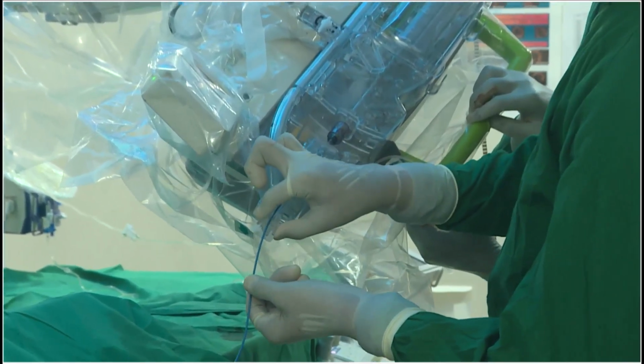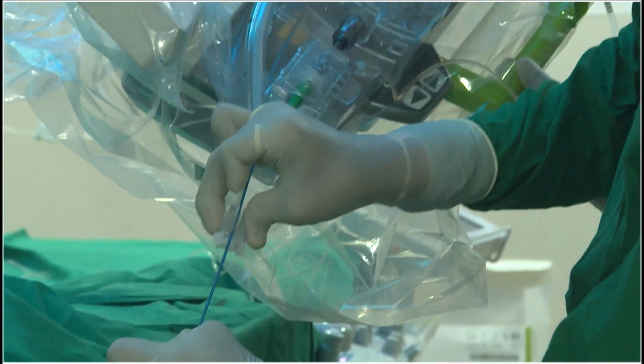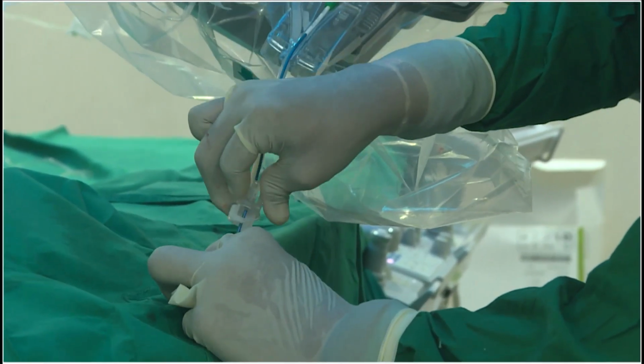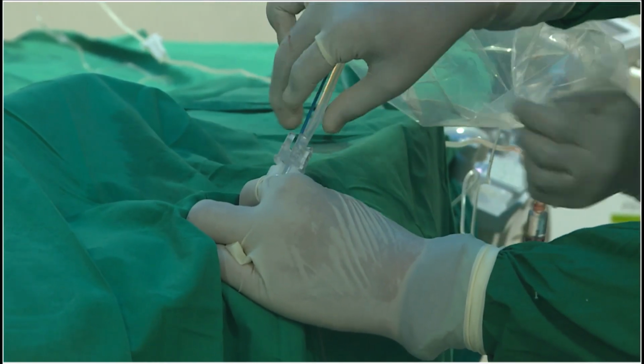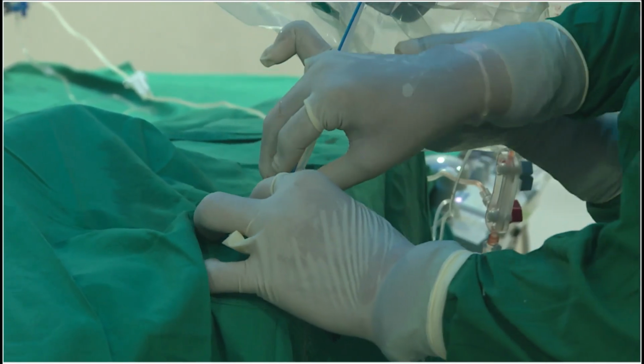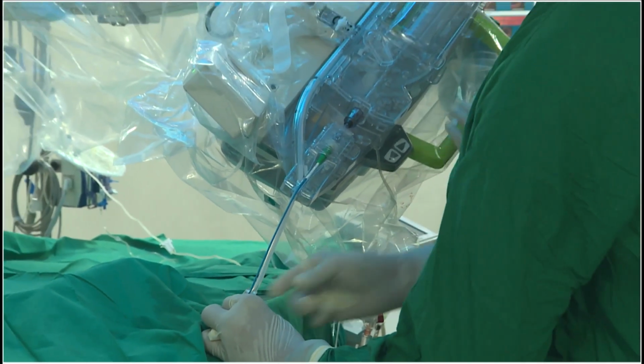So this is the arm we have to lock to the sheath, so the robot would have control of the sheath also. So we are putting it down. You can see this is a sheath. One second, I'll do it again. The guide has not gone into the lumen. Just pull it back.